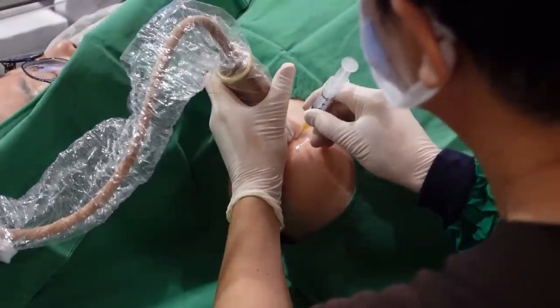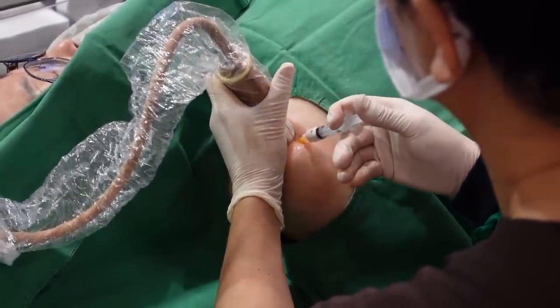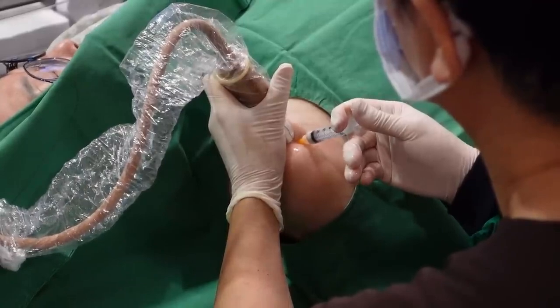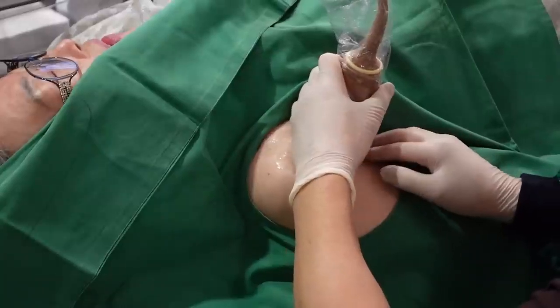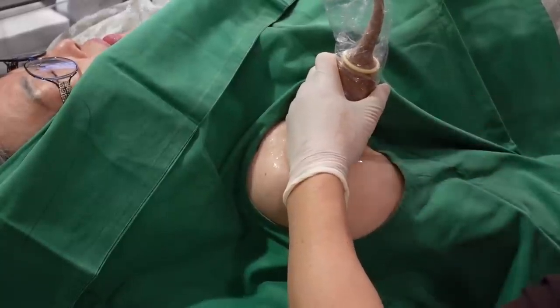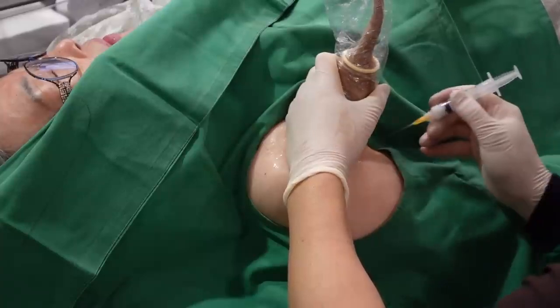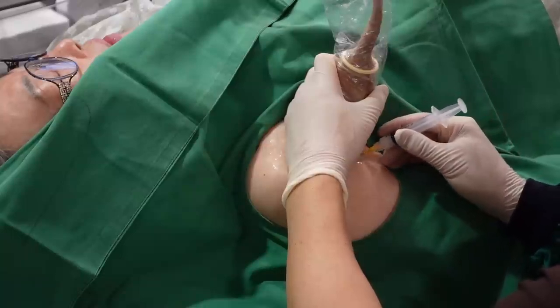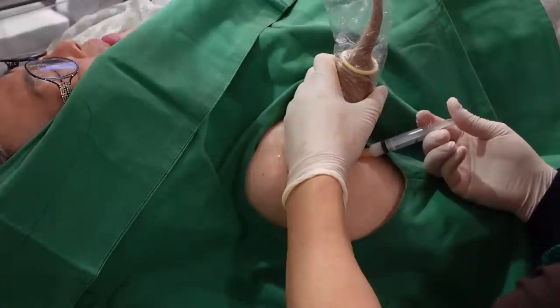Now, I will discuss the ultrasound-guided procedure for osteoarthritis. As you suspected, the basic principle is the same. The ultrasound-guided protocol follows the same technique as an ultrasound-guided adhesive capsulitis injection procedure. In adhesive capsulitis, the first target is the coracohumeral ligament, and the second is the inferior capsular attachment site at the humeral neck region. But we need a modified technique. Here is how I modify the targets.